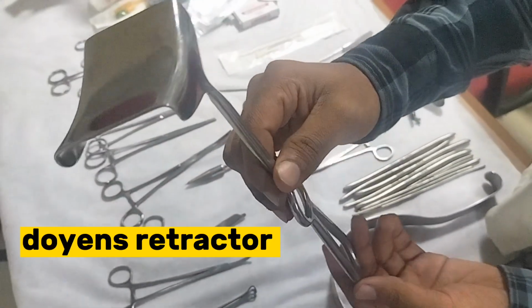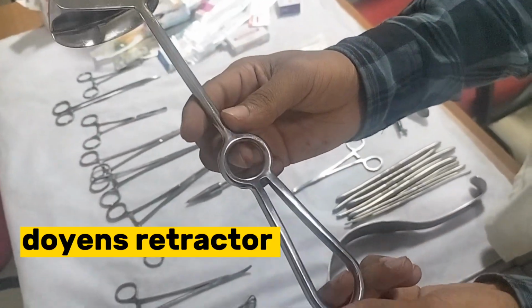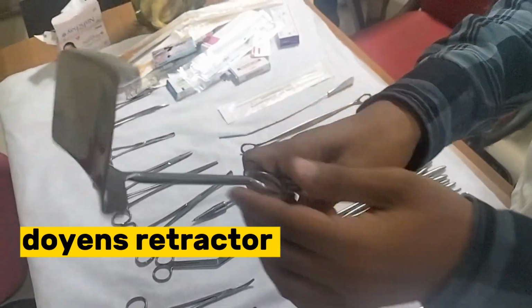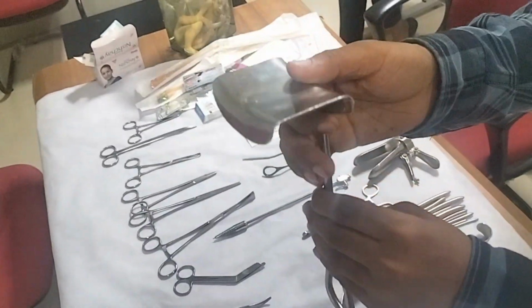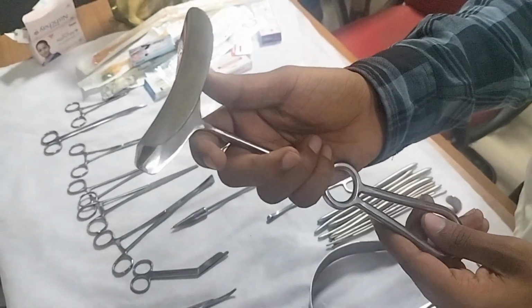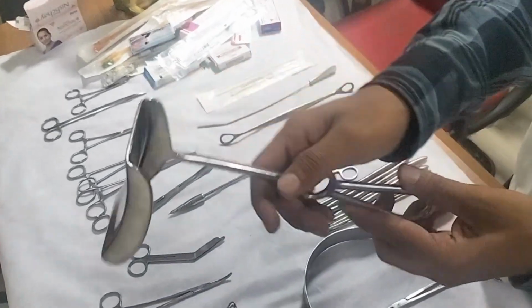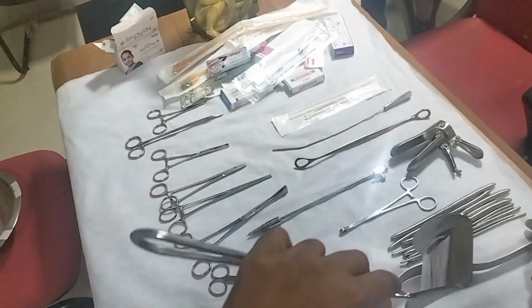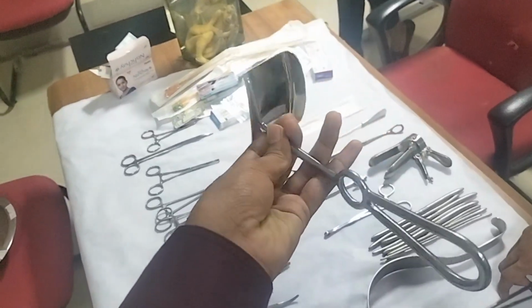Here we got Doyen's retractor. In the center we got ring for reducing the weight of the instrument, and we got good metallic shaft for holding, and this is for retraction in case of abdominal hysterectomy, cesarean sections, and in surgery used to retract rectus sheath. Okay, Doyen's retractor is used to retract the bladder for LSCS surgery. Doyen's retractor.